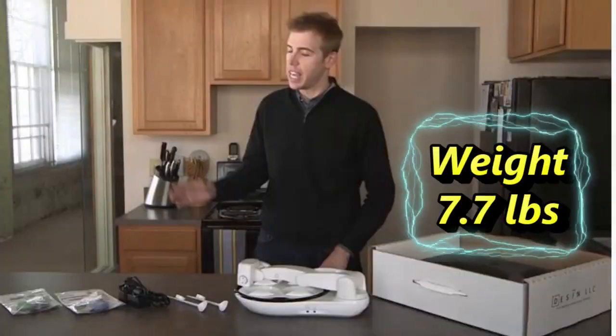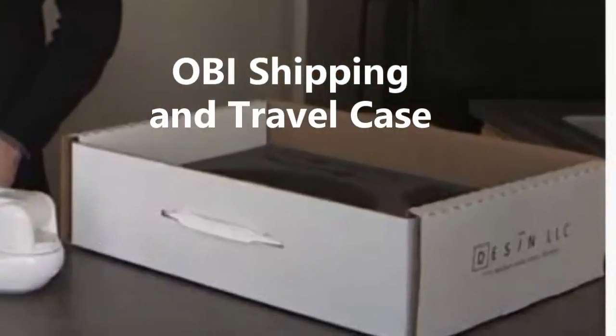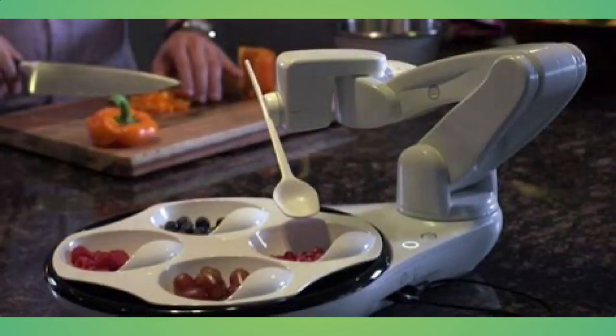Cindy and I will demonstrate the Obi being used in all three of these locations, plus some videos of me using it from a swing-away table in front of my lift recliner. Cindy will feature a sampling of many food dishes easily handled by either of the two spoons that come with the Obi, and I will explain what the two switches do next.